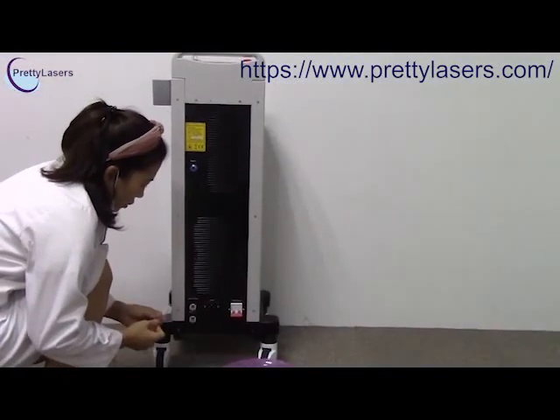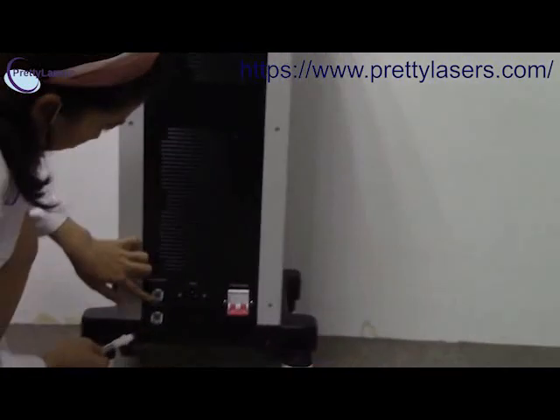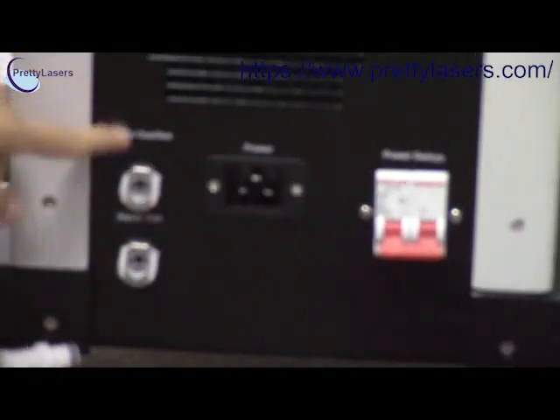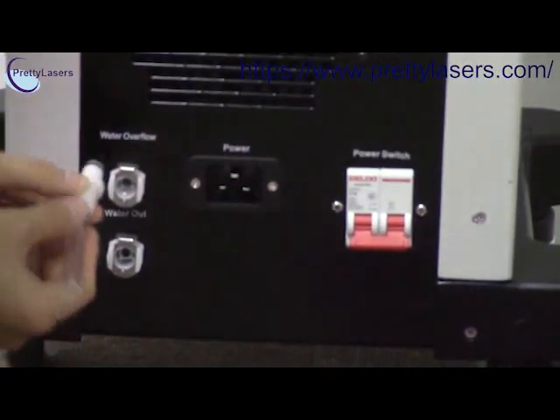Now we insert the tube into the water flow hole. You can see the hole — there is a tip. Before installation, we have to make sure this tip is up. Then insert.